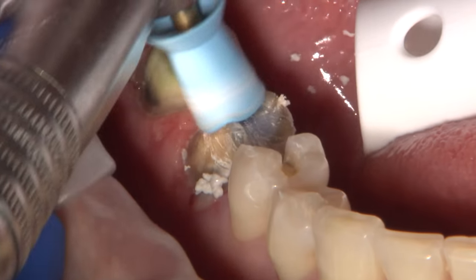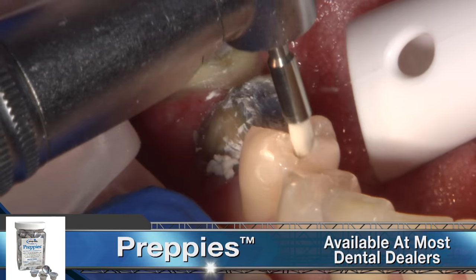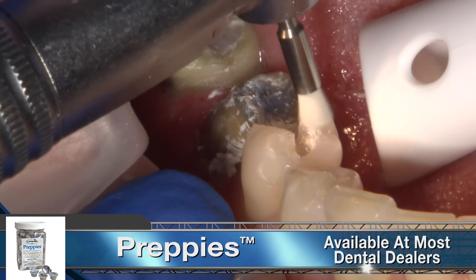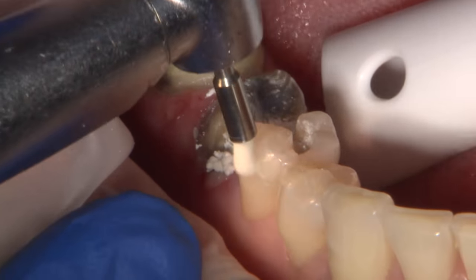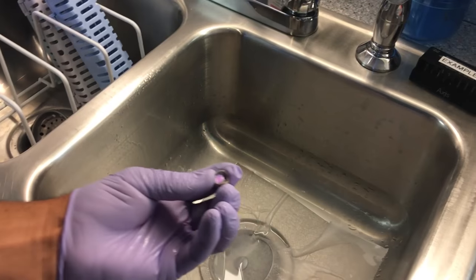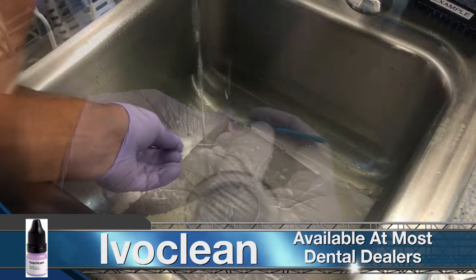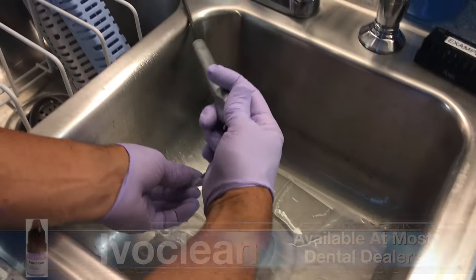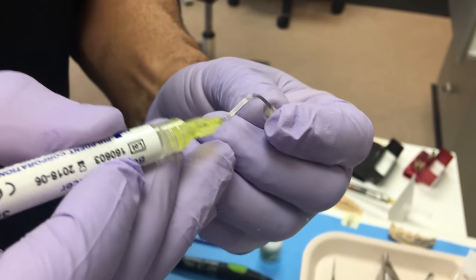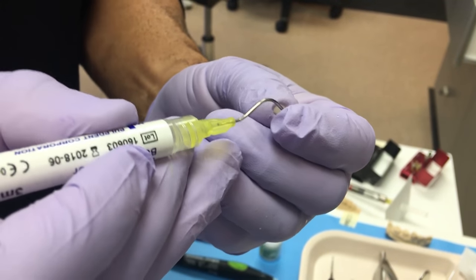Prior to cementation, preparations were pumiced with Prepisil paste, rinsed and dried. We use Relyx Unicem for the cementation of the inlay and Relyx Luting for the metal restorations. Here is my assistant using Ivoclean to decontaminate the intaglio surface of the metal crowns. Here is using Silane to get the inlay ready for cementation.